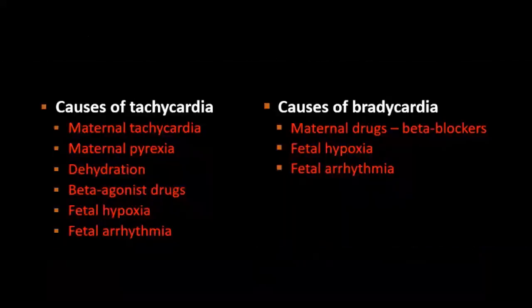So what are the causes of fetal tachycardia or fetal bradycardia? You need to look into whether the mother has tachycardia or fever, chorioamnionitis, whether the mother is dehydrated or on beta agonist drugs, or the baby has fetal hypoxia or arrhythmia, which can also cause fetal tachycardia. Whereas for fetal bradycardia, you need to look into maternal drugs such as beta blockers, or whether the baby has hypoxia or fetal arrhythmia.